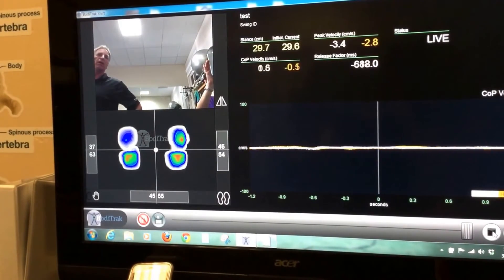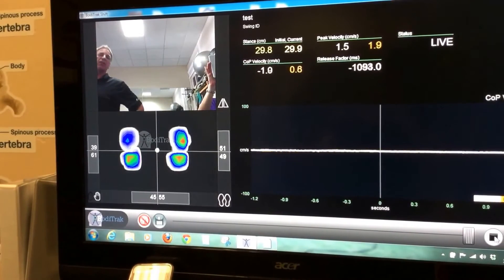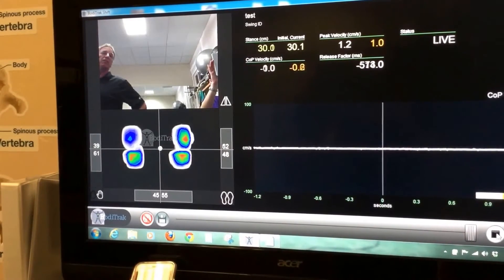As I get tall in the spine, we see the cueing for a more stable front-to-back. We want the weight in the lace tops — that's where we want it — and we want to have a sense of where that stability is in the foot, which is what we'll talk about in our next section: the short foot exercise.